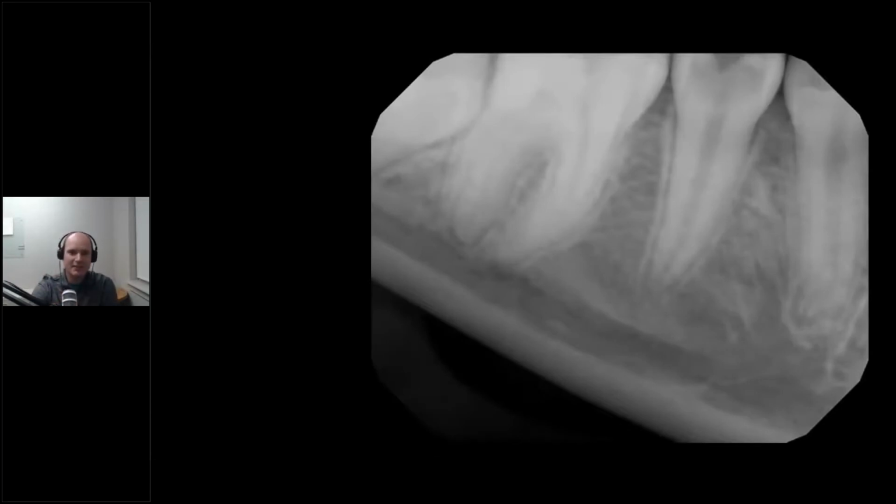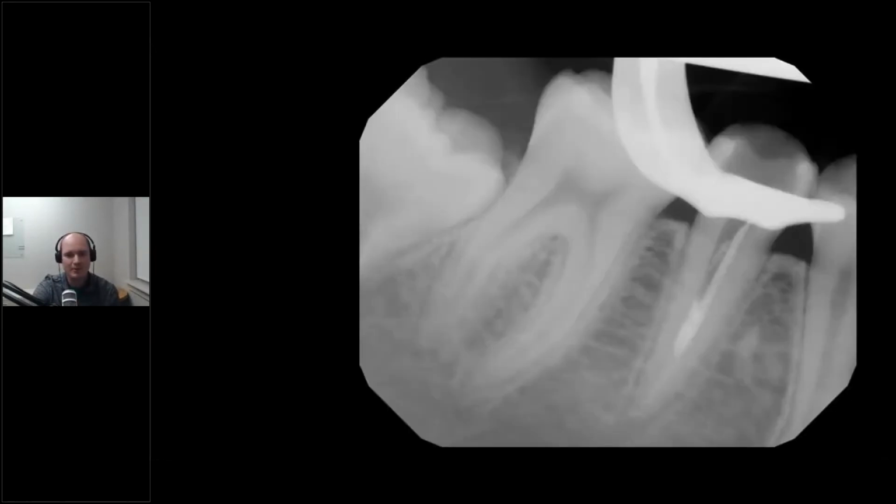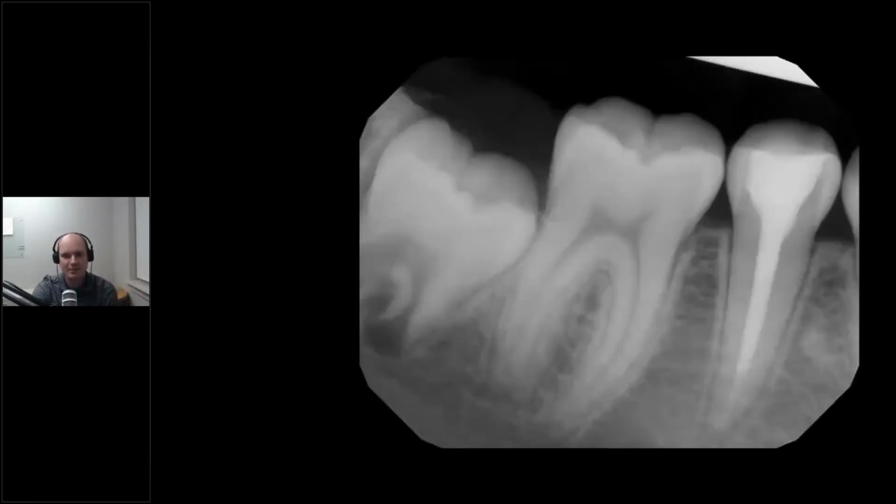Here's a deep lesion that had irreversible pulpitis. I couldn't get the bleeding controlled, so we ended up doing an apical barrier with Biodentine. Extensive tooth loss here. You can see on the coronal portion, we removed the gutta percha down, and then this was bulk filled all the way back up with composite to strengthen the tooth, trying to avoid a permanent crown. Very low caries risk kid. She didn't really have anything else, so being conservative with the composite on that. And the composite is going to also help build strength being filled all the way down the canal versus a post, which might weaken the tooth.